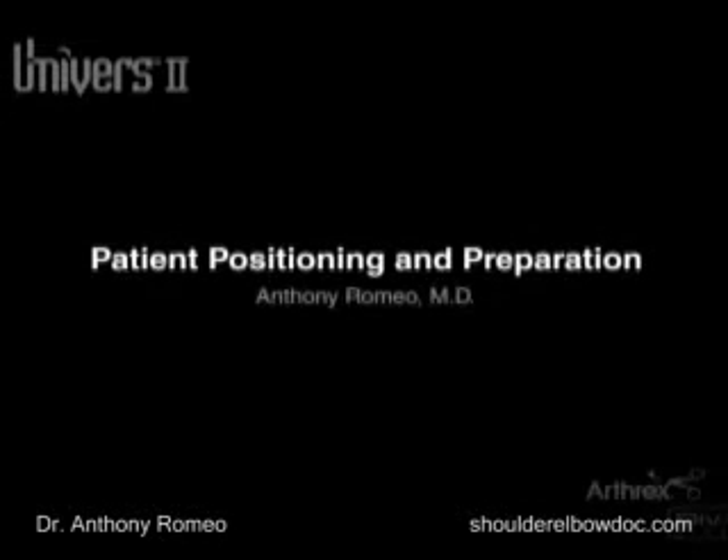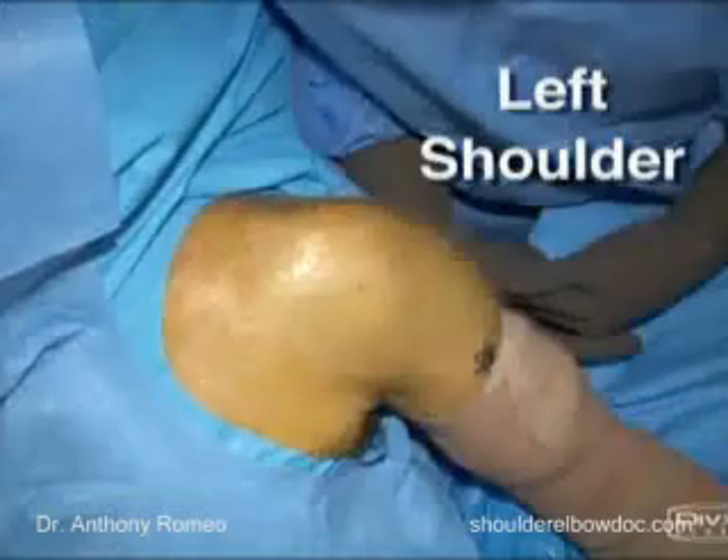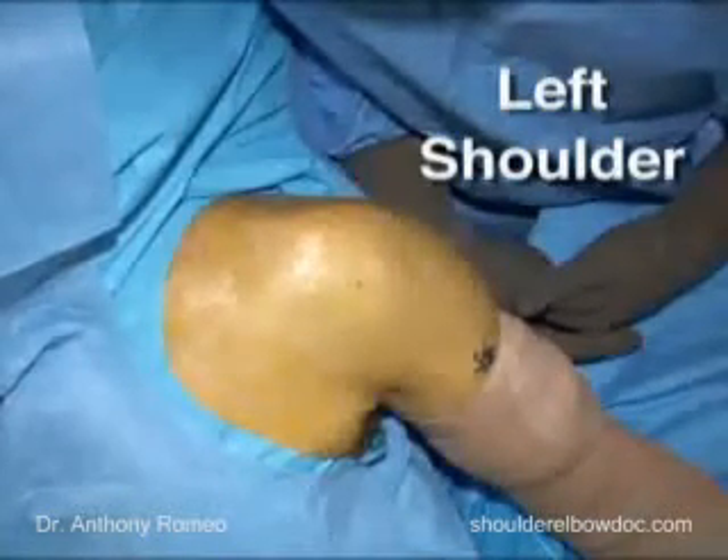Today we're going to demonstrate a left total shoulder replacement. This is a 54-year-old physician who has had more than a three-year history of left shoulder pain, which is now debilitating with his activities of daily living, not only his work responsibilities.